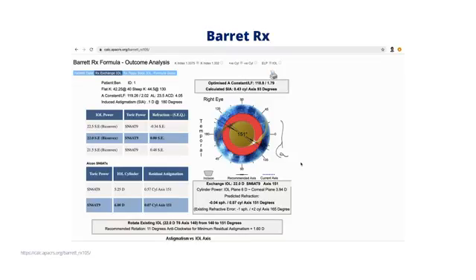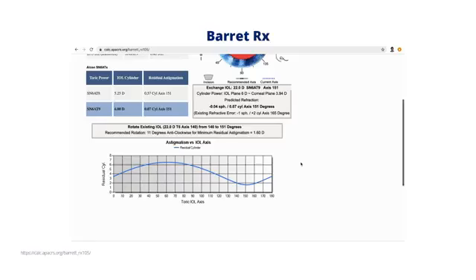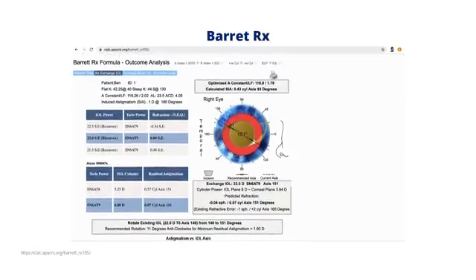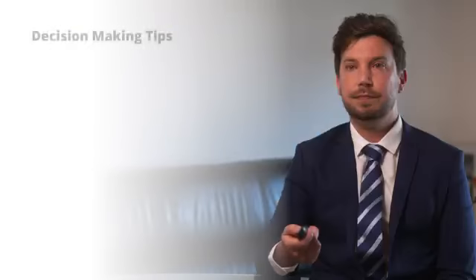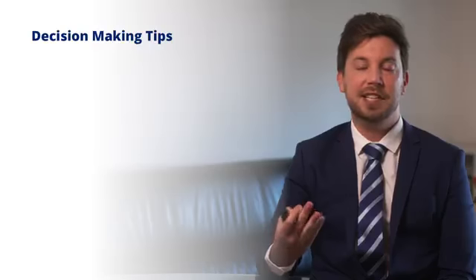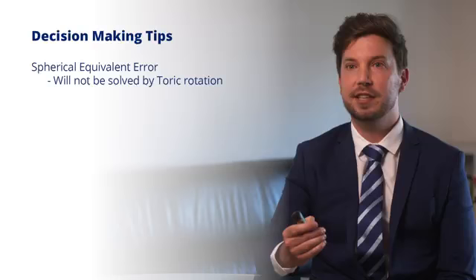So this will tell us whether the sphere and cylinder power need changing and what the optimal location will be, as well as the expected refractive outcome. So a huge amount of information, a little bit more complicated in terms of what you need. You will need some new biometry for this method, but you know, a very powerful tool.